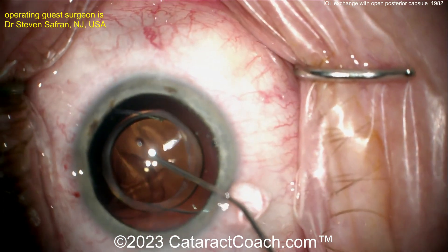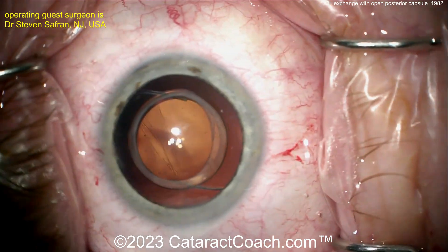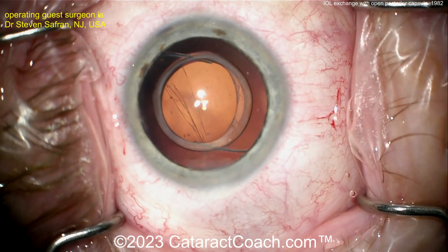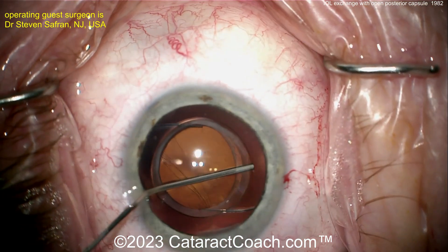But why does it look so deep if the posterior capsule was thought to be intact? Look carefully — adjust the lighting. You can see the vitreous going down there, and those lines confirm it: this is an open posterior capsule. So now, what do you do? More challenges ahead.